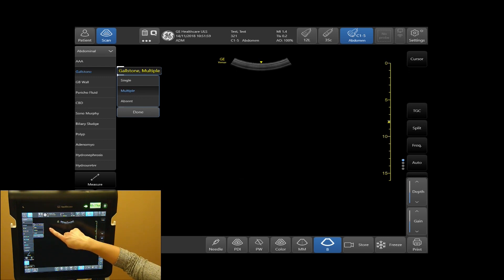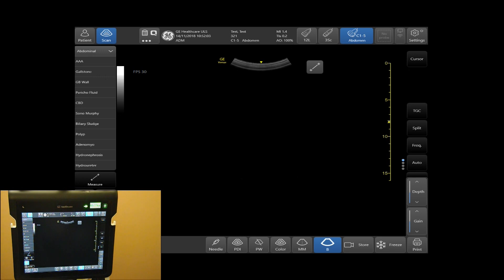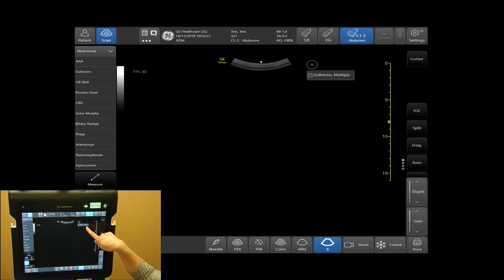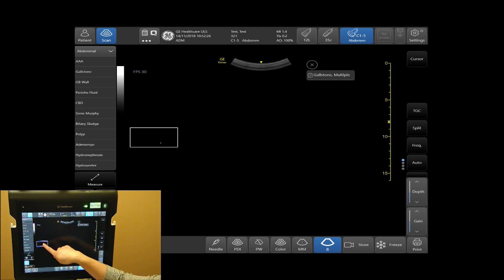When you are complete, tap done. If your findings do not appear on your touch screen panel, select your measurement tab and your findings will appear. Your findings can be placed anywhere on your screen by simply tapping and dragging on your touch screen.